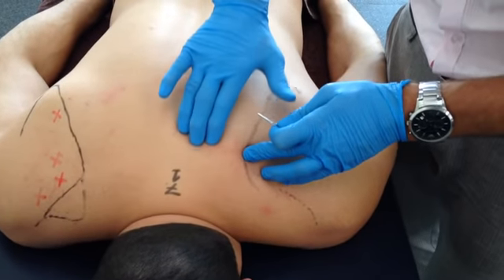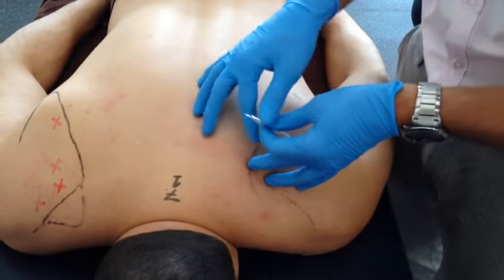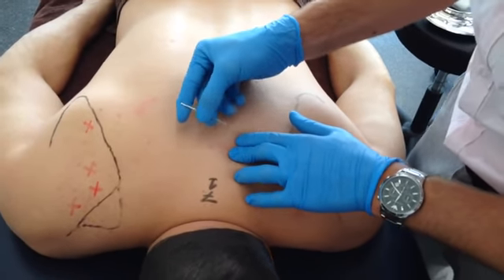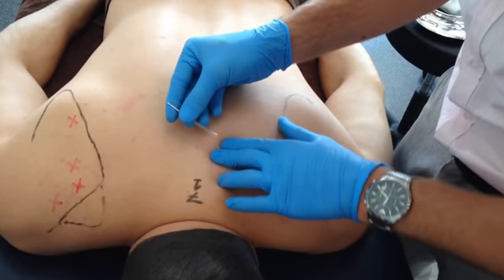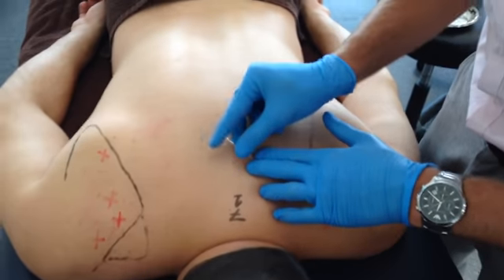Taut bands in the mid-fibres of trapezius should be palpated for and secured with middle and index fingers over a rib. The area should then be needled in a medial to lateral direction at an acute angle towards the spine of scapula.